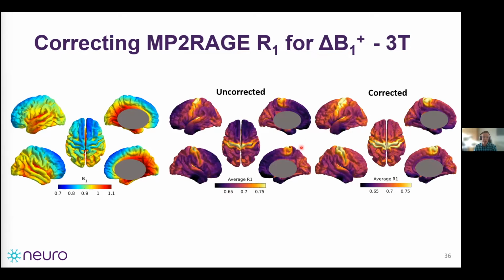Another apparent change is a slight increase. Here we can see, if we look for it, that the decrease in the B1 also ends up here in this R1 value, where it's much more homogeneous across the frontal cortex. And again, it's important to correct for this, otherwise we might take this difference as being structurally relevant, when in fact it's just an issue with the scanner hardware.